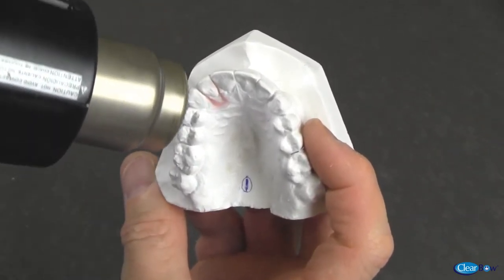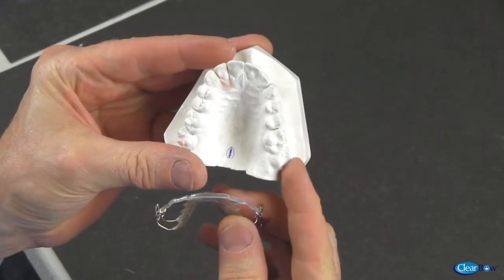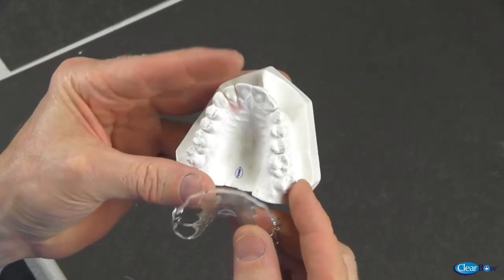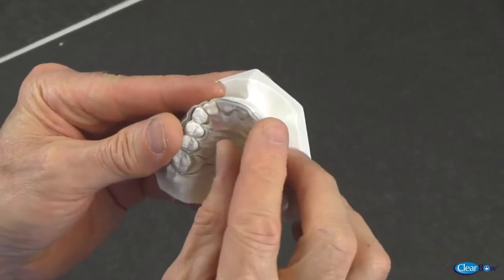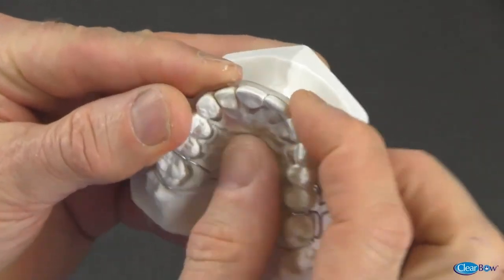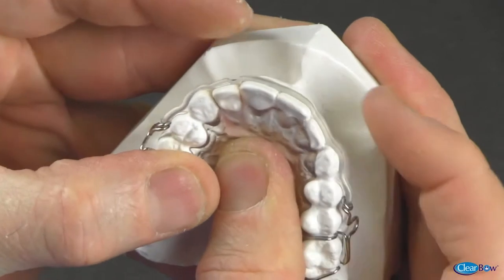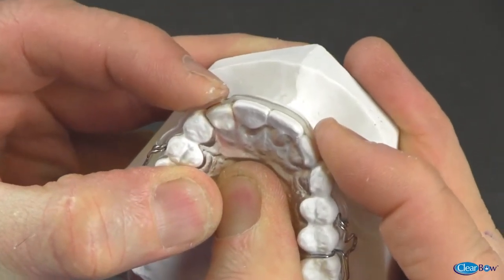Heat is applied on model number one to soften the wax. The retainer with the adjusted clear bow is placed on this model. The clear bow will apply pressure to the lateral tooth simulating actual tooth movement.